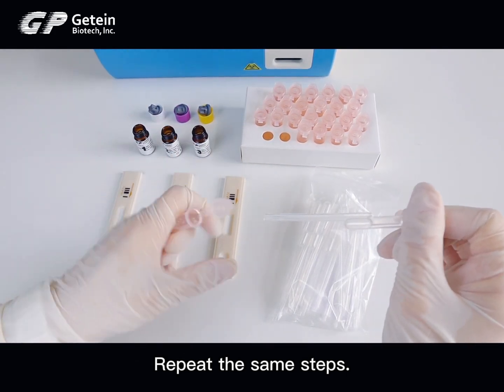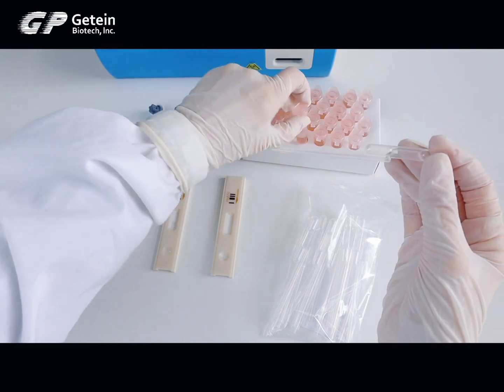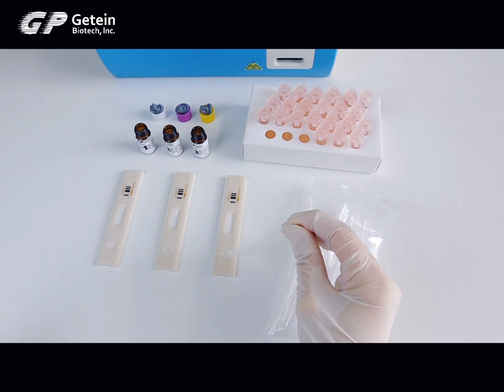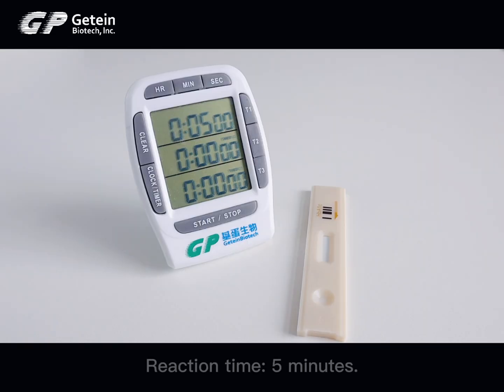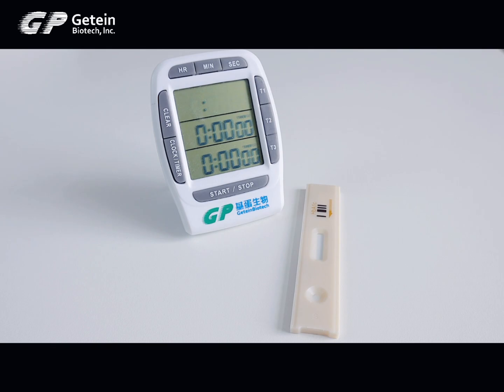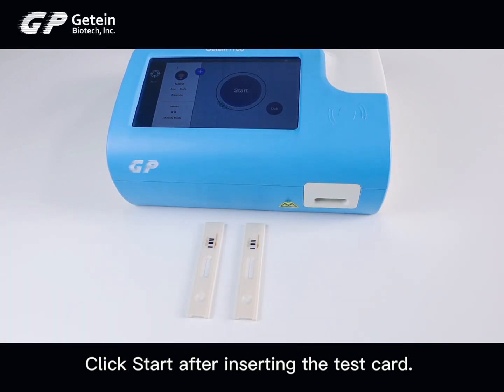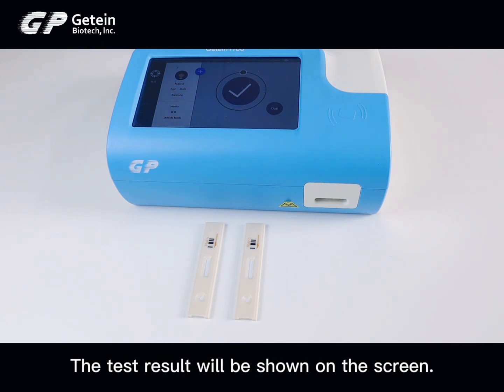Repeat these same steps for each control level. The reaction time is 5 minutes. Insert the test card into the analyzer when the reaction time has elapsed, then click Start. The test result will be shown on the screen.